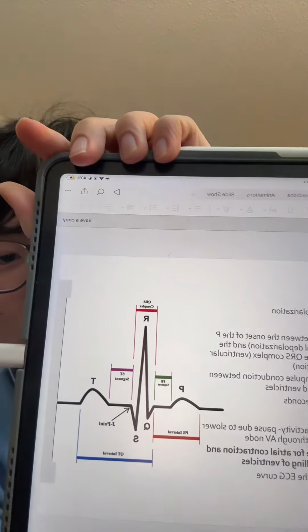And you're going to see in the hospital, you'll see EKGs or ECGs, you'll see those leads before they connect those wires. That is basically going to be in a triangle formation because of Einthoven's triangle, where we don't want the charges to interact with each other to interfere and mess up how we see the waves of your heart in this measurement. So I'll explain it. So this is going to be the EKG.